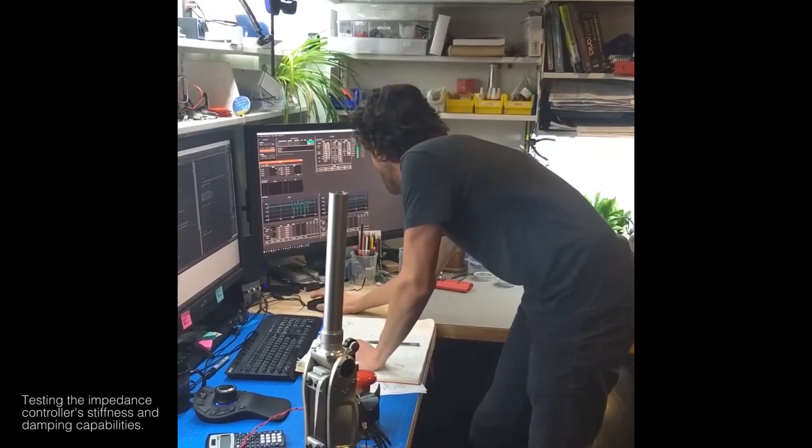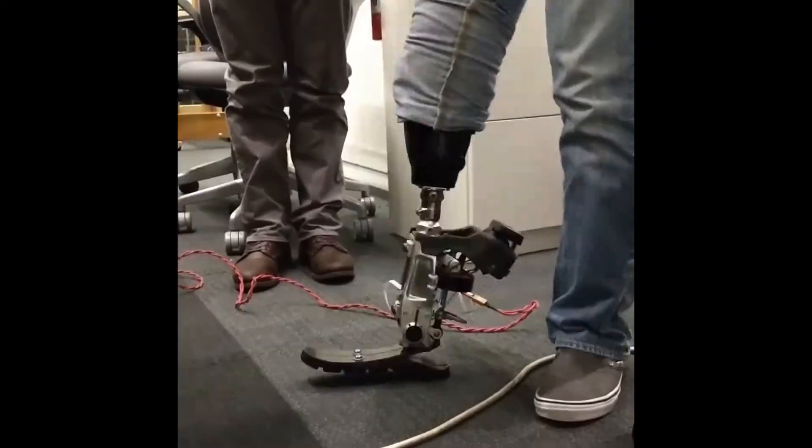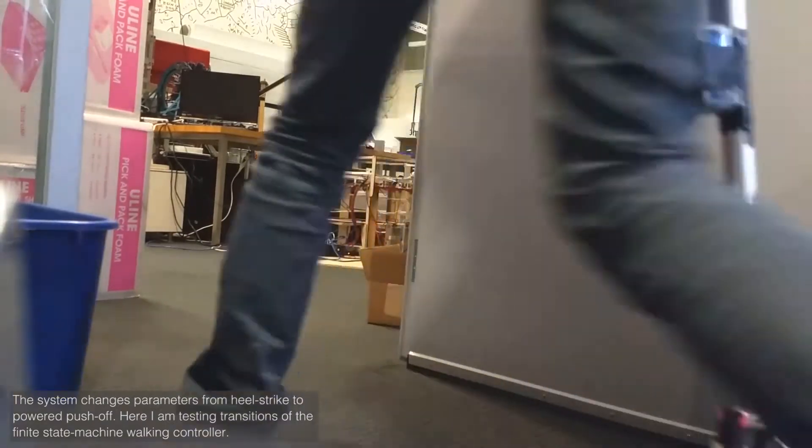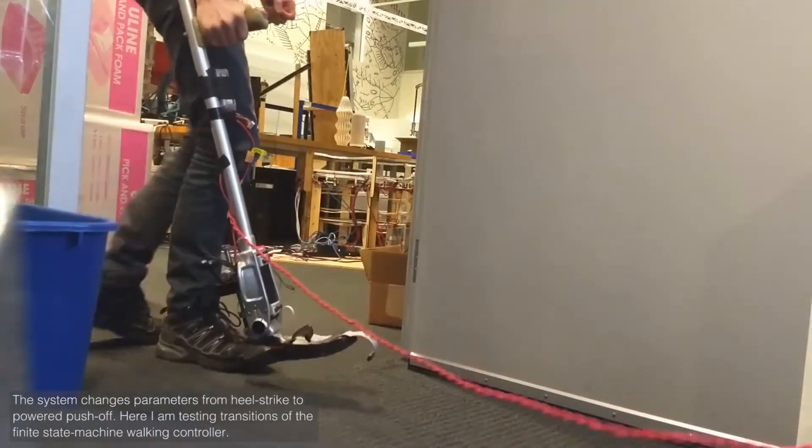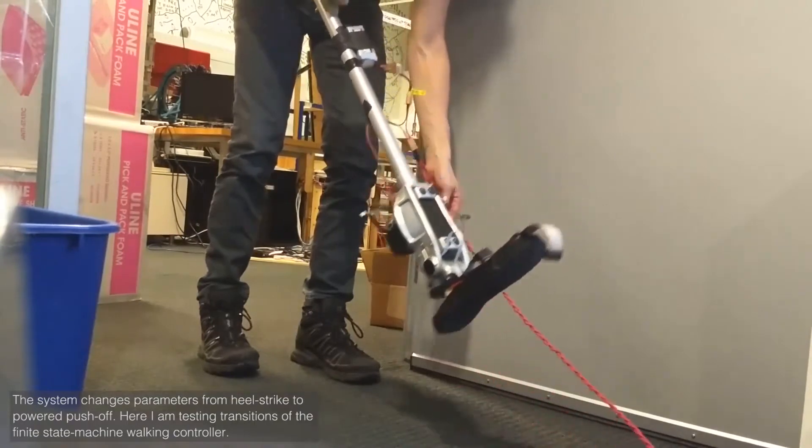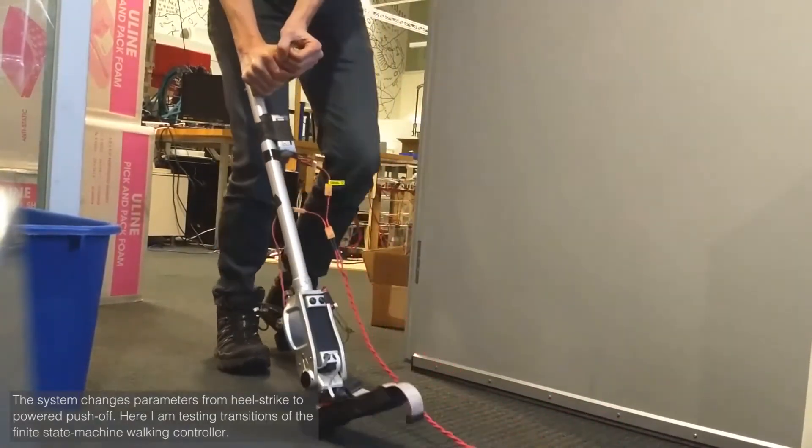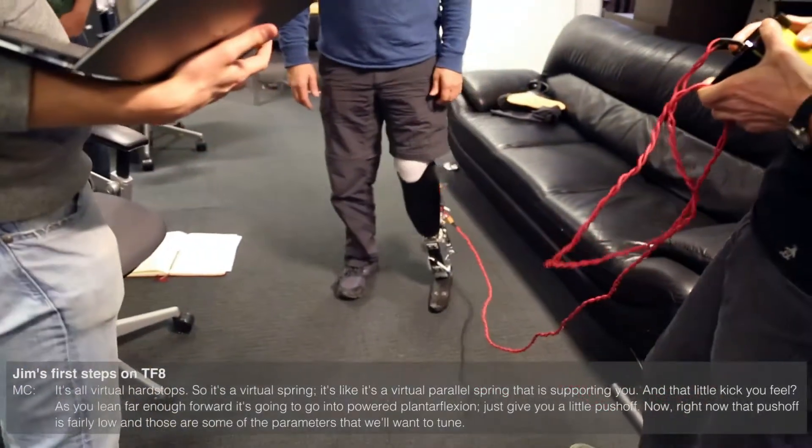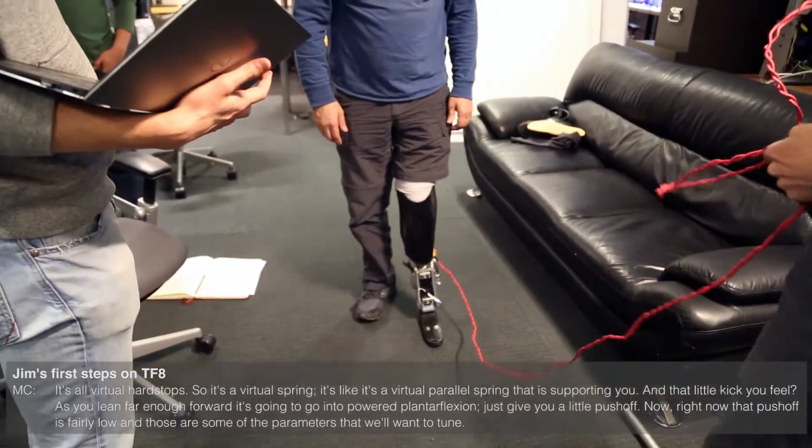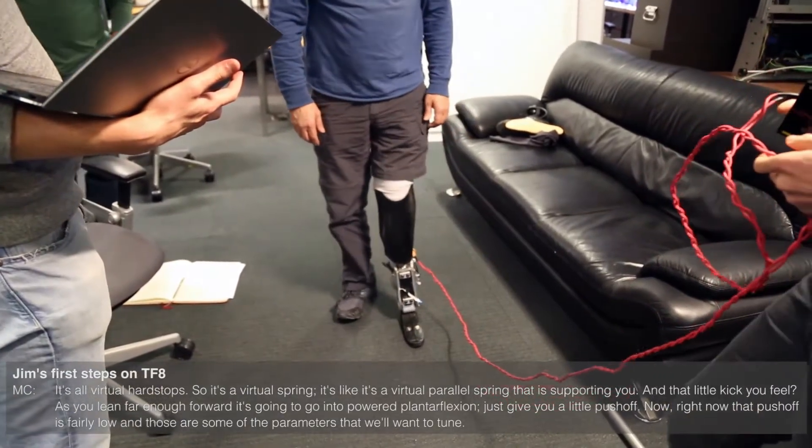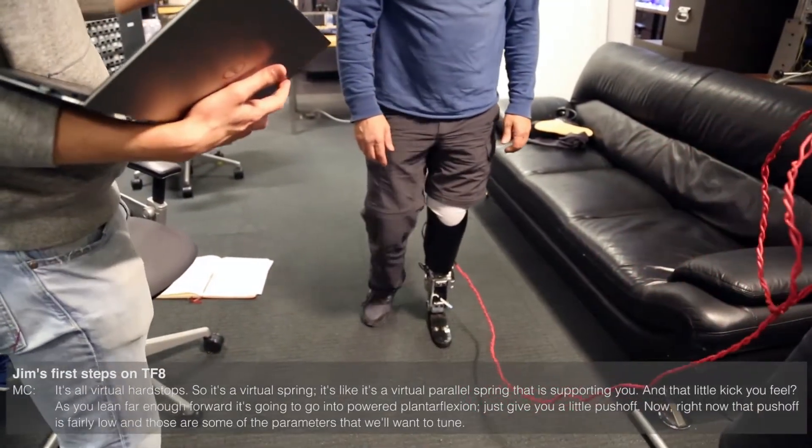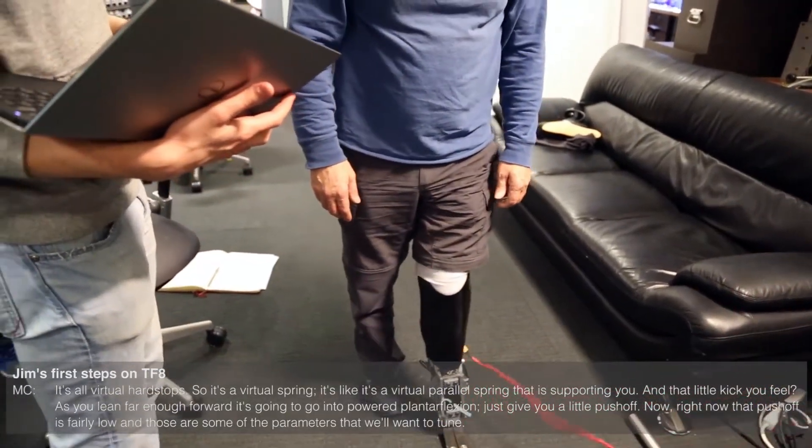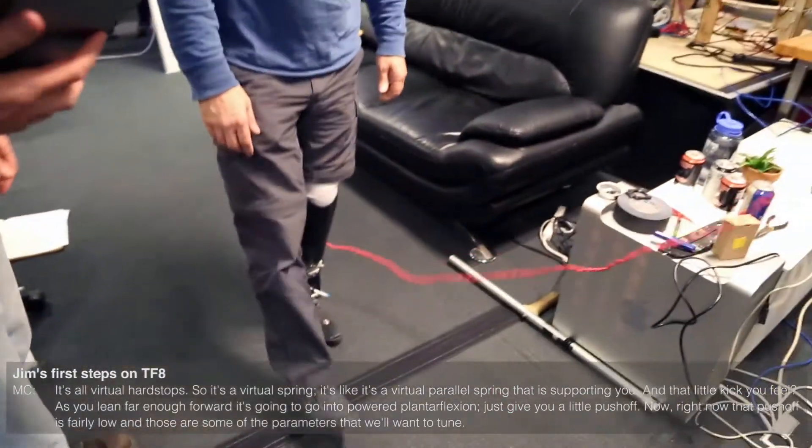I'll do a table for you. It's 30 Newton meters. It's all virtual hard stops, so it's a virtual spring, a virtual parallel spring that is supporting you. That little kick you feel as you lean far enough forward is going into powered plantar flexion. Let's give you a little push-off. Right now that push-off is fairly low, and those are some of the parameters that we'll want to tune.